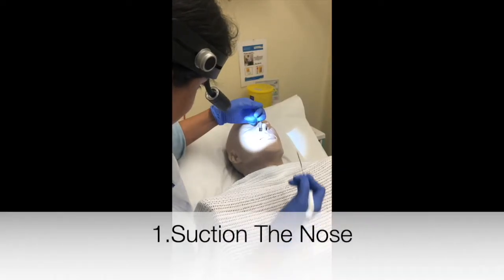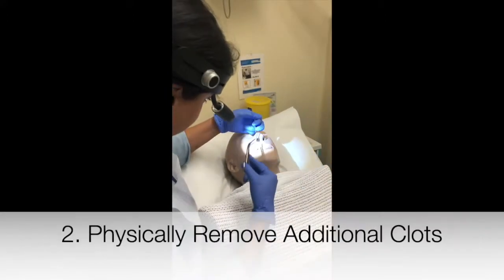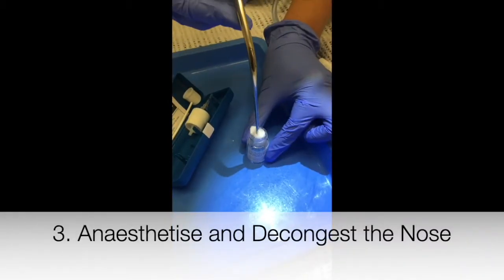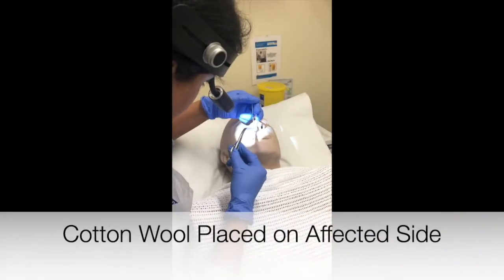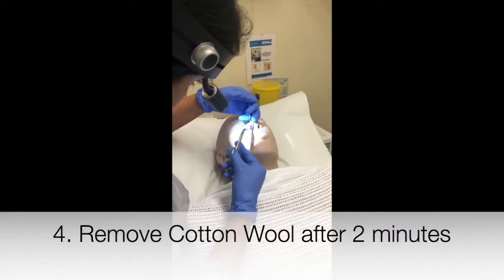First, suction the nose removing any clots. Physically remove additional clots using Tilly's forceps. Put cotton wool into local anaesthetic and decongestant, then place the cotton wool onto the affected side. Remove the cotton wool after two minutes.